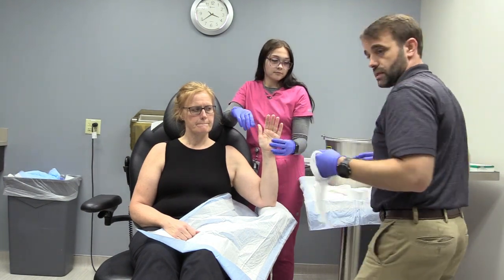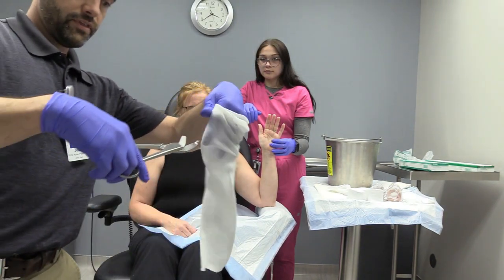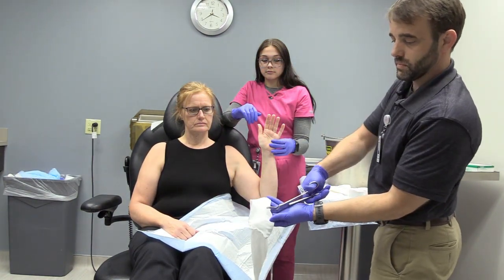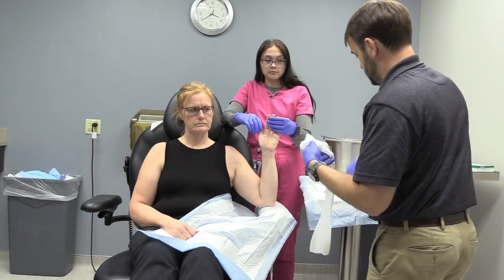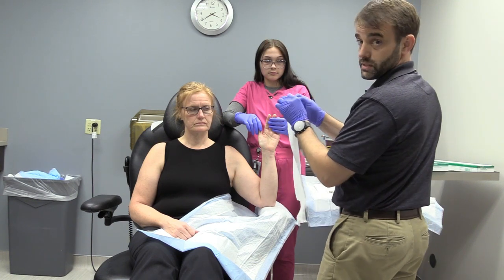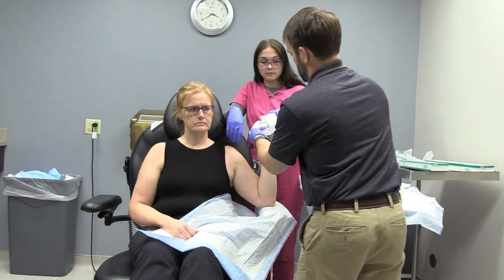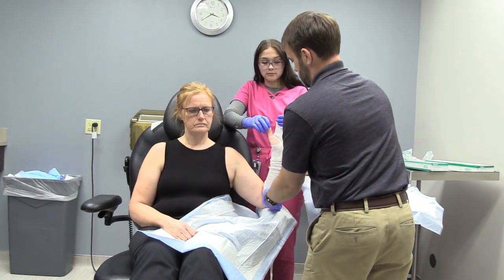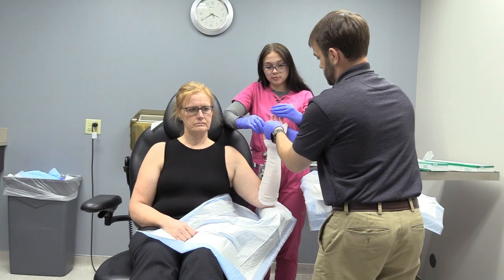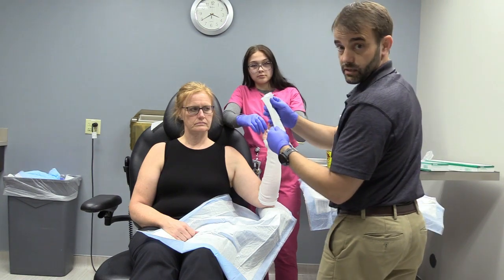So I'm going to grab a scissor, sorry. Put a little hole for the thumb. Right about there. It doesn't have to be that big because it will stretch. And I like to use a stockinette underneath because it's more comfortable, and also you can use it to hold your plaster later. So it's always nice to have an assistant to hold things to keep them from falling too. Good there. And then I also like to put a stockinette on the fingers as well.